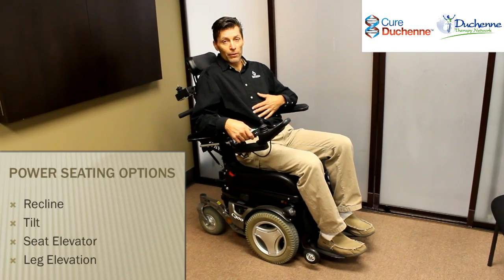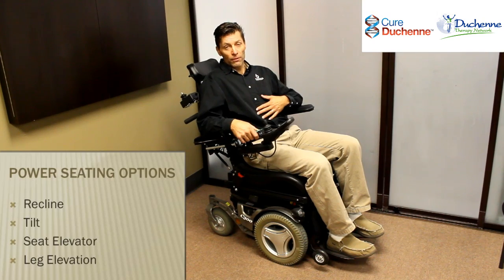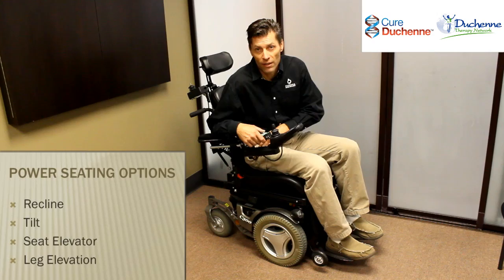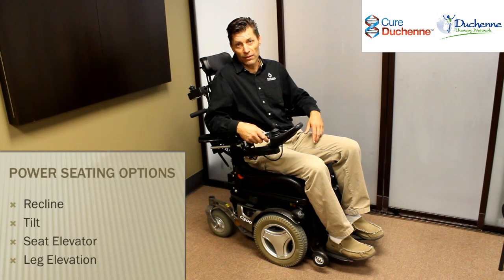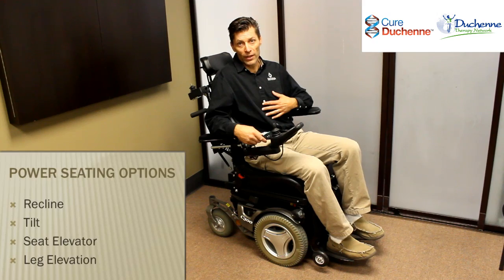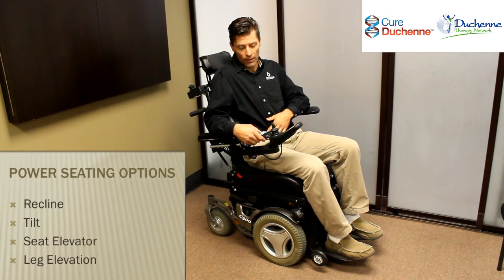You watch, it's letting me open up my hip to torso angle, which can be useful for a variety of things. One is just to keep range in the hip joints. Another, though, is that as human beings, we place our bodies at different positions to be able to do different things. And if you don't have the strength to do that with your own muscles, then you can use these powered seating features to help you do that.